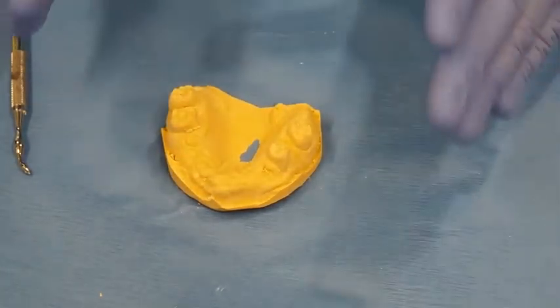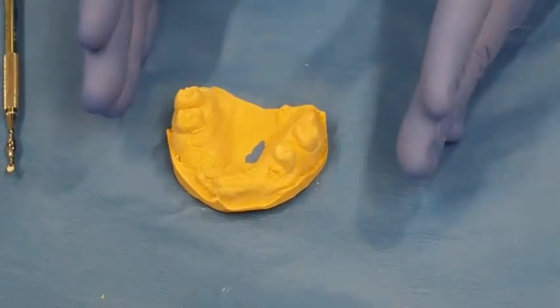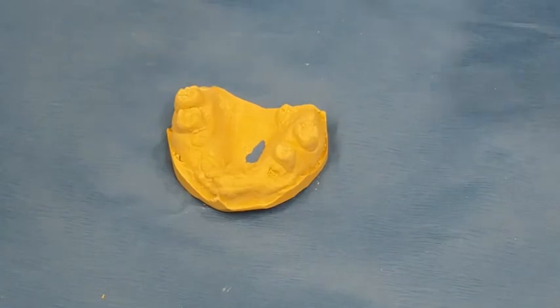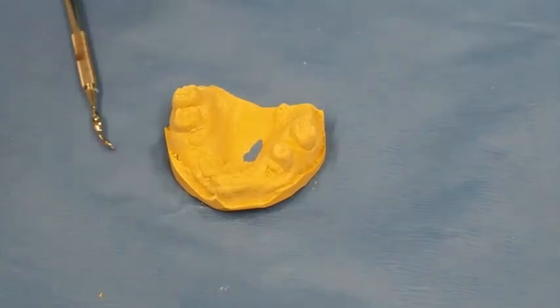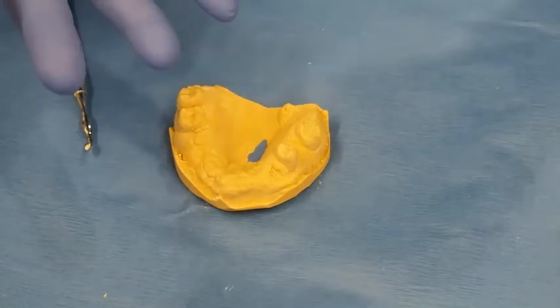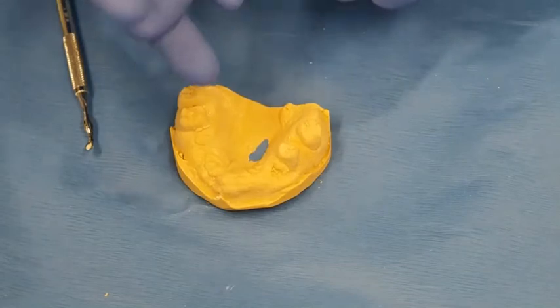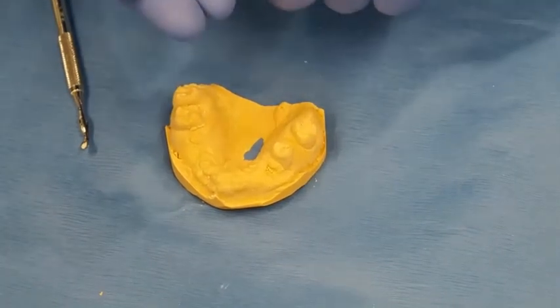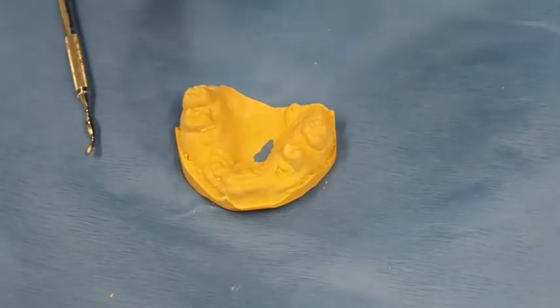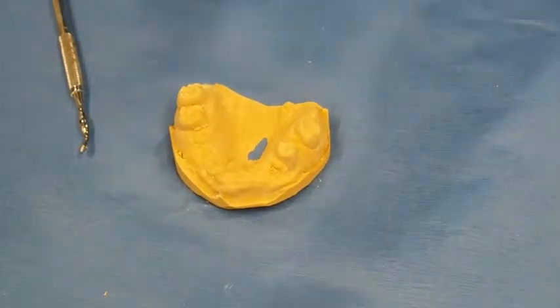So this is what the special dentures technique, or this course, will teach you how to do. In a normal edentulous patient, we take preliminary impressions, custom trays, final impression, base plates, wax rims, tooth try-in, and final delivery. In this case, we're going to take a preliminary impression, which is what we have.